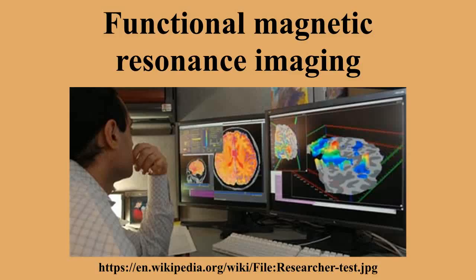More recent characterization of the BOLD signal has used optogenetic techniques in rodents to precisely control neuronal firing while simultaneously monitoring the BOLD response using high-field magnets. These techniques suggest that neuronal firing is well correlated with the measured BOLD signal, including approximately linear summation of the BOLD signal over closely spaced bursts of neuronal firing. Linear summation is an assumption of commonly used event-related fMRI designs.